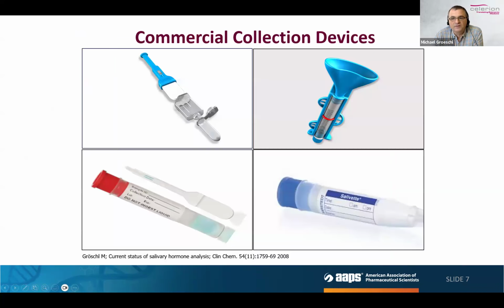Now let's move to saliva collection. Here only a few examples are shown. When I first conducted my own research on this topic, there were almost no commercial collection systems available. They came on the market around the year 2000 and have now developed a wide variety.